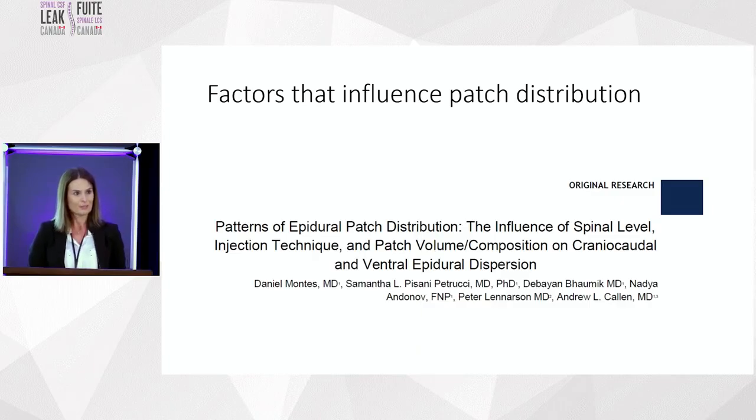And then as a physician who is doing these blood patches, of course, we want the best outcomes for our patients. So we're always interested in knowing the factors that may influence patch distribution. There have been a lot of papers published in the past, based on contrast studies where a contrast is injected and we see where the flow of the contrast goes, and that gives us an idea of how the blood will react as well. But very recently, Dr. Callan, who is amongst us today, published this very interesting study where he did a CT-guided epidural blood patch and fibrin as well, and actually documented the spread of the actual blood. So not just the contrast, but the blood.